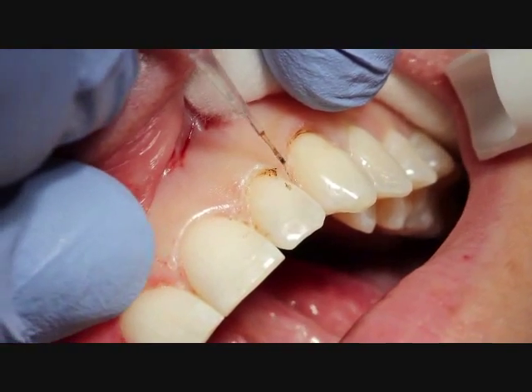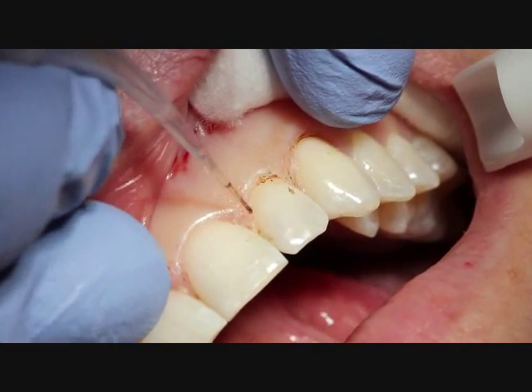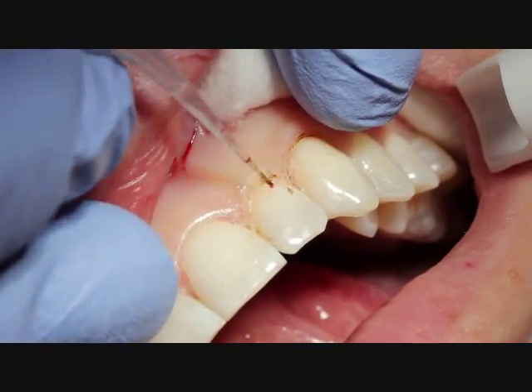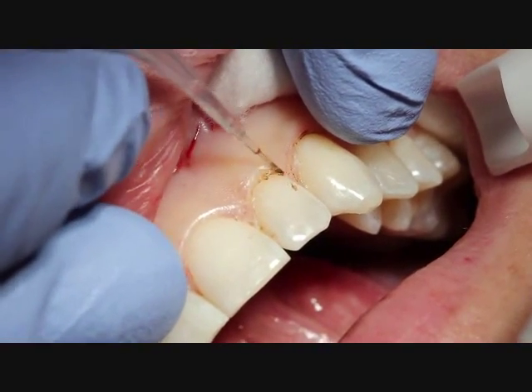Just slight angulation to create somewhat of a bevel when we remove that tissue. And you can see the laterals gaining a little length — just a real nice procedure.